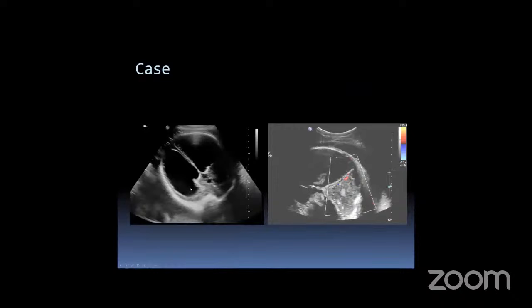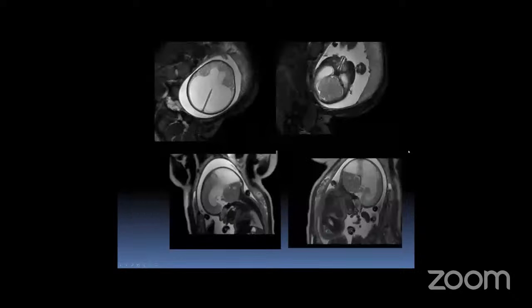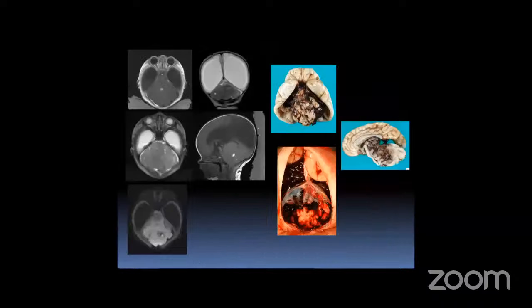We diagnosed this as a posterior fossa teratoma. After birth, postnatal MRI confirmed the posterior fossa mass with areas of hemorrhage and restricted diffusion. Unfortunately this baby passed away, and pathology showed a large mass invading into the cerebellum and midbrain — this was a medulloblastoma. Another case at 28 weeks: hydrocephalus with heterogeneity in the choroid plexus and echogenic ventricular walls. MRI showed the ventriculomegaly and on T1-weighted images confirmed blood within the ventricle, caused by neonatal alloimmune thrombocytopenia.